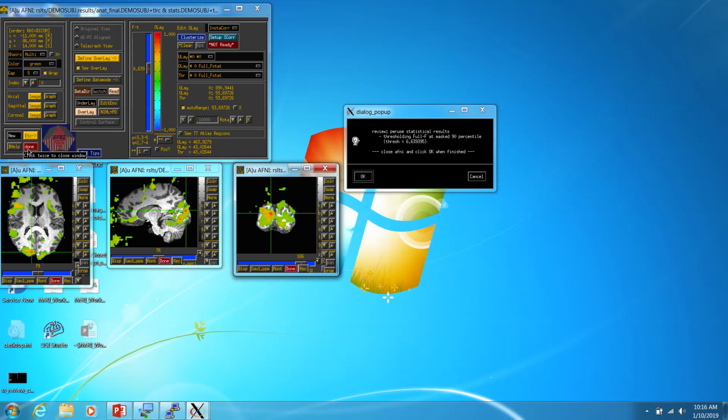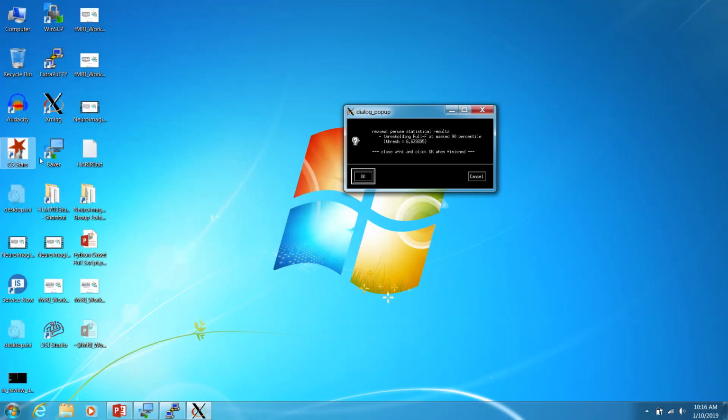Yeah, for example, just real fast. When we first did this, the first 10 or so subjects just weren't looking right. Whit and Michelle and I were beating our heads, wondering what was wrong. We ended up figuring out that there was something weird about the timing. We thought our models were great, but there was a difference. They were throwing out scans, or we thought they were throwing out scans, or they weren't. Something weird like that. But we figured that out only because those positive controls just did not look right. So it's really important to convince yourself the data is good.